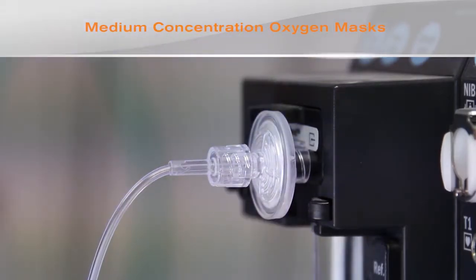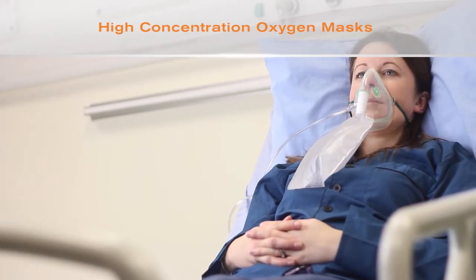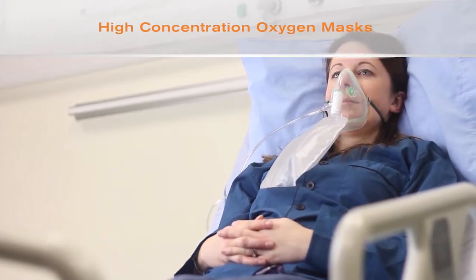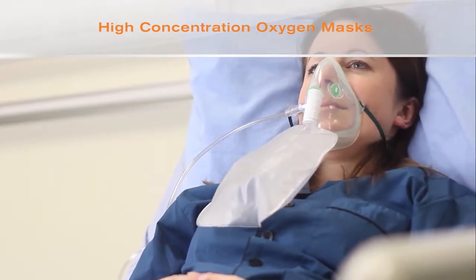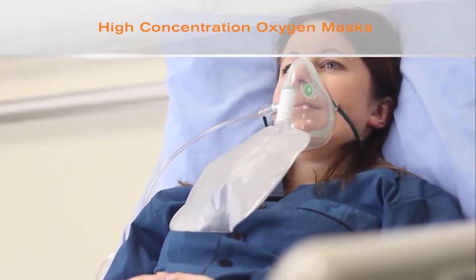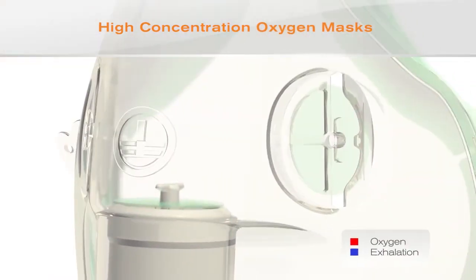The final variable concentration oxygen mask we are looking at is the high concentration mask, also known as the non-rebreathing mask, and is usually used when high concentrations of oxygen are required, for example with the critically ill or unstable patient. The patient breathes from the mask and the inspiratory valve opens so that oxygen is taken from the reservoir bag. The patient breathes out through the expiratory valve.